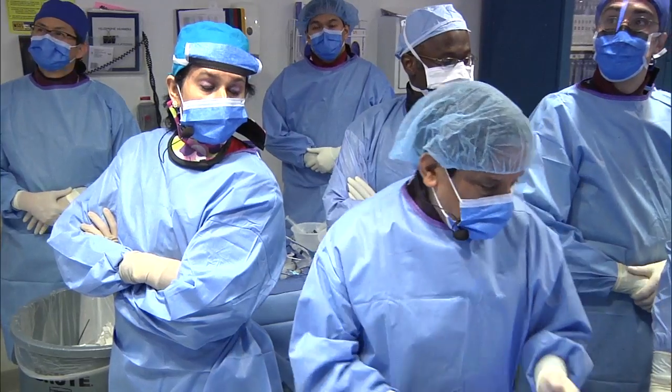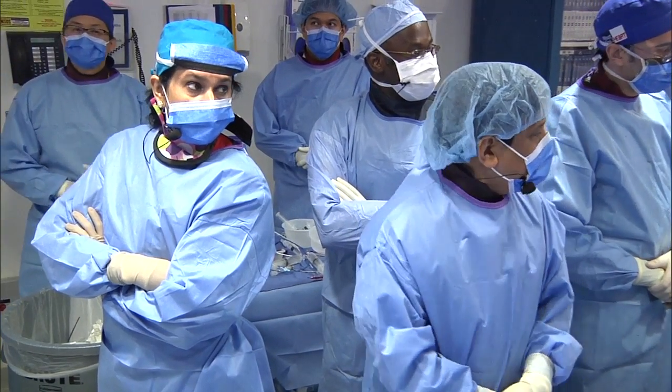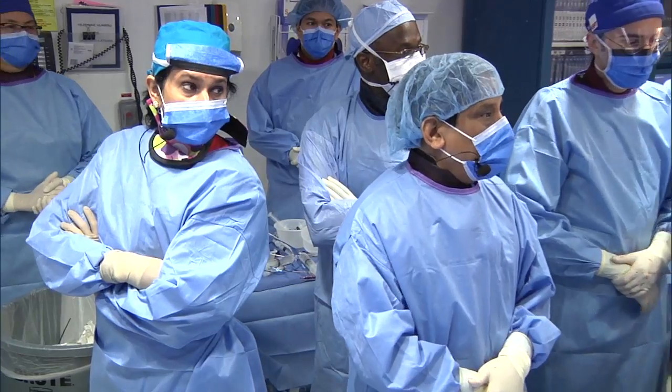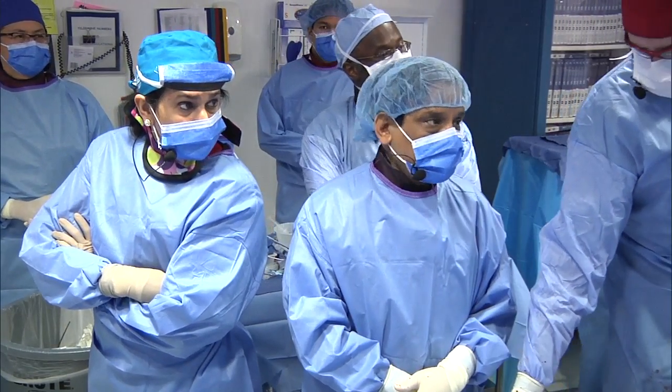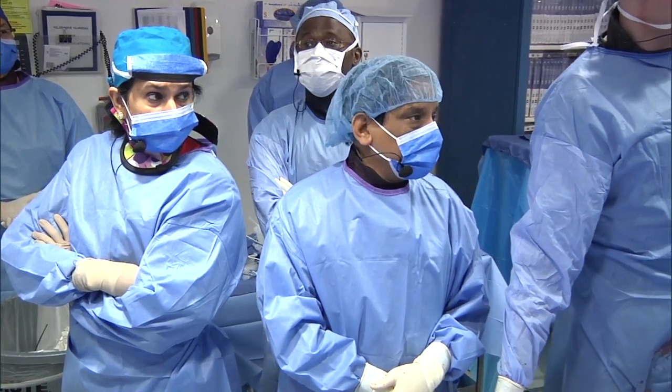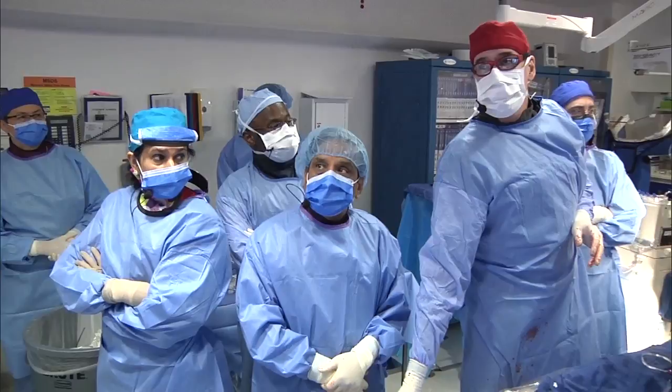With that note, we need a little final comment from Alan and anybody else. How are you doing now? Actually, he has done, yes. Show you the completion of the access. If you just show the cine, please. So there was our final valve shot. If you just show the angiogram, please.